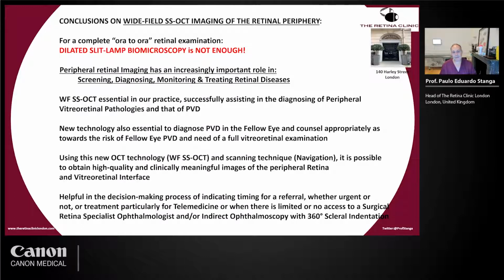Peripheral retinal imaging has an increasingly important role in screening, diagnosing, monitoring, and treating retinal diseases. And not only to rule out retinal tears, but also, for example, in diabetics. Widefield swept source OCT has become essential in our practice.